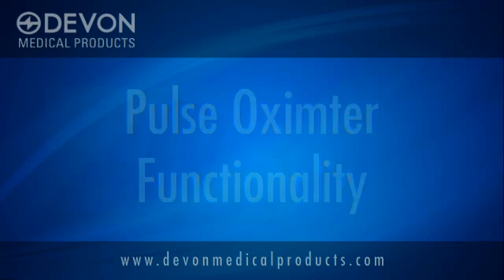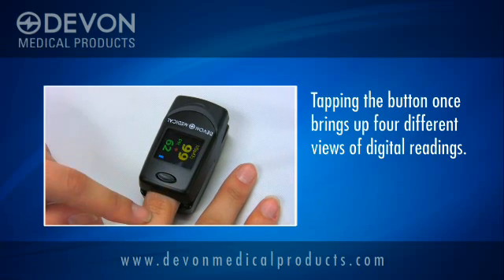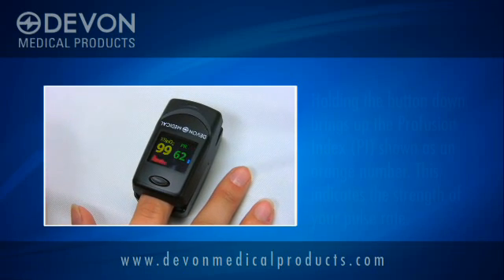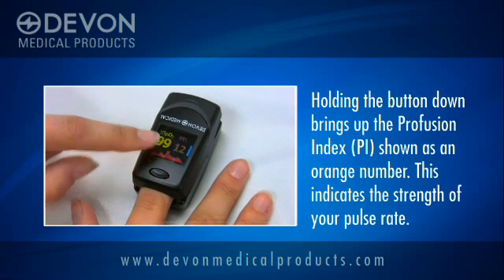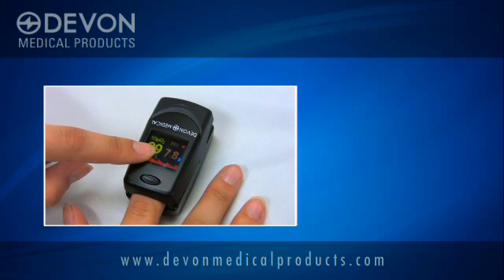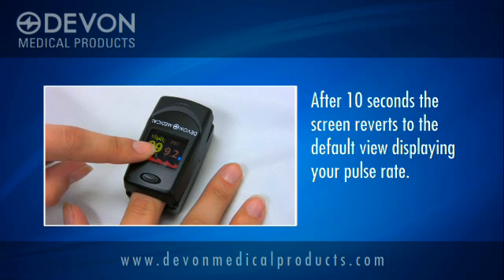Now let's look at the unit's functionality. Tapping the button once gives you four different viewing angles for convenient readings. Holding the button for two seconds will give you yet another reading. The orange numbers measure perfusion index, or PI, which tells you the strength of your pulse rate. After ten seconds, the screen will go back to its default mode, showing the pulse rate.